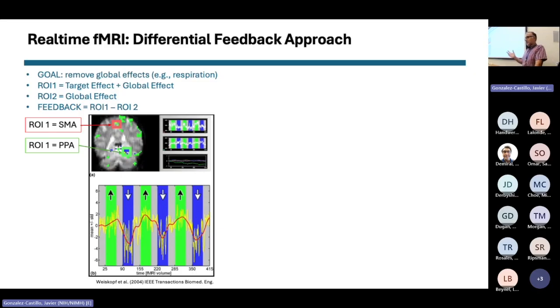When we're talking about neurofeedback, the idea is that people somehow are able to control their own activity level in a given location. So what this tells you is not only that, but that they can control that differential, presumably.